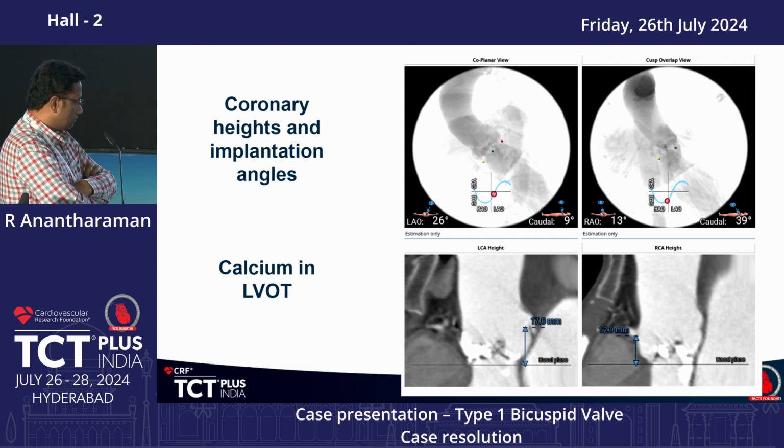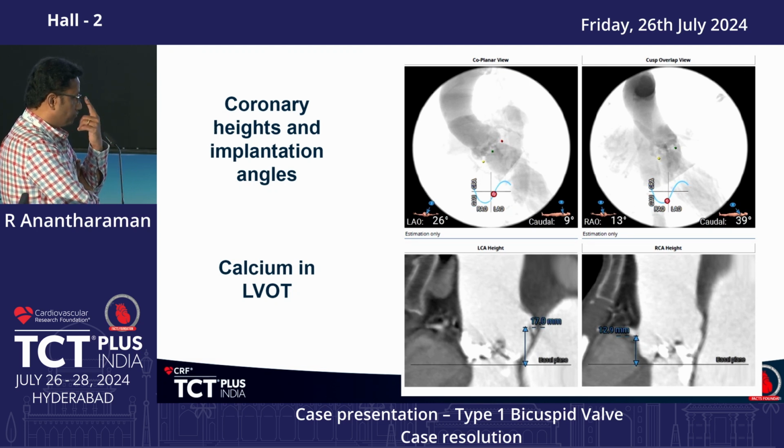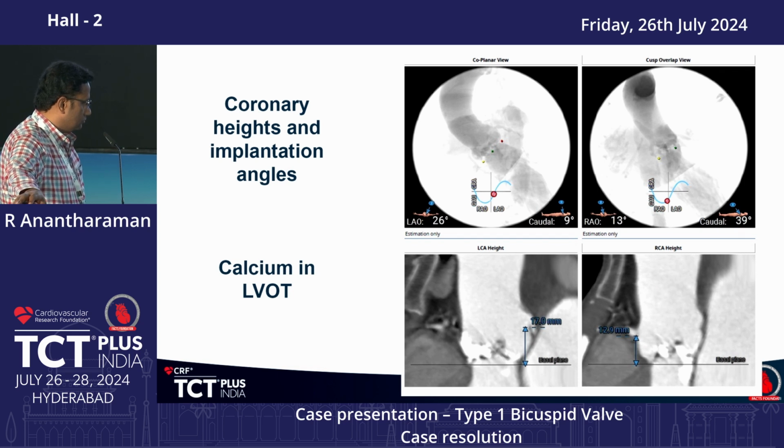And the vessel sizes are very small. So when you use a balloon expandable valve in India, then you think about it. What is the 14 French E sheath going to expand to? And what actually is the Python sheath when the valve goes through, right? It's preloaded. So the Python sheath needs almost 6.5 millimeters or more, right?